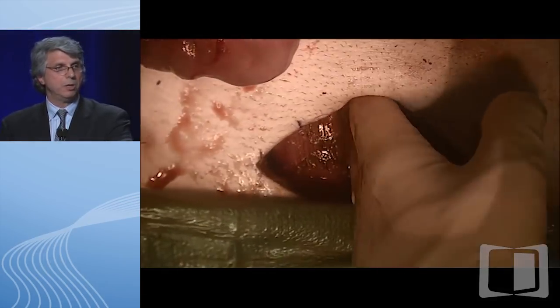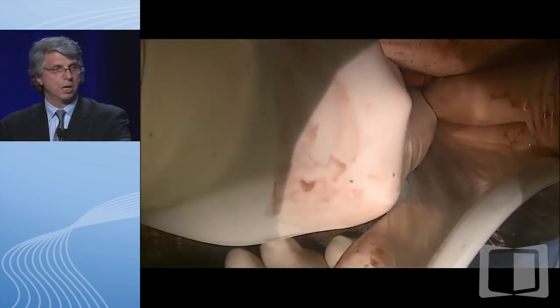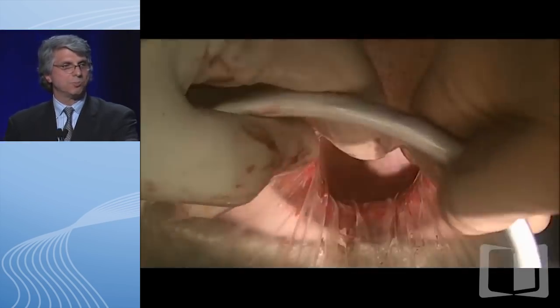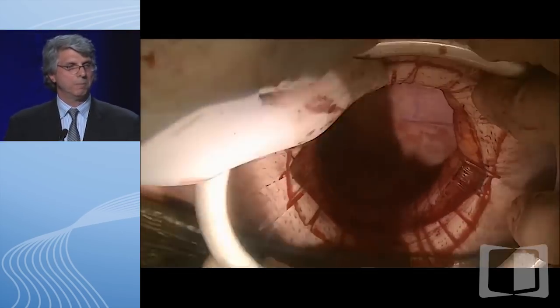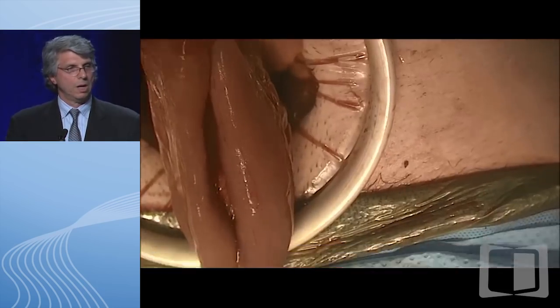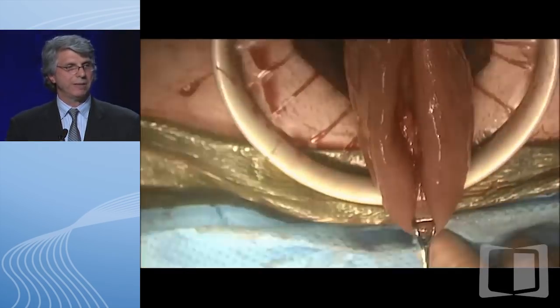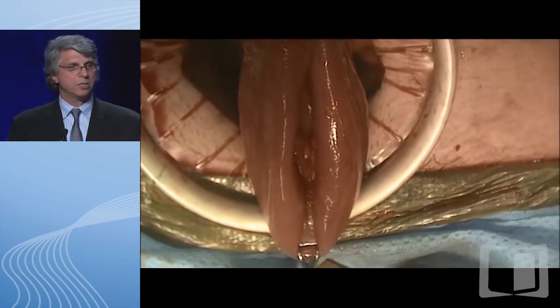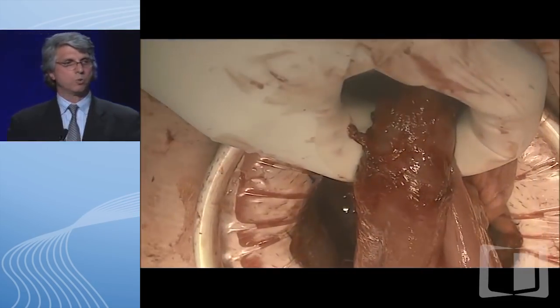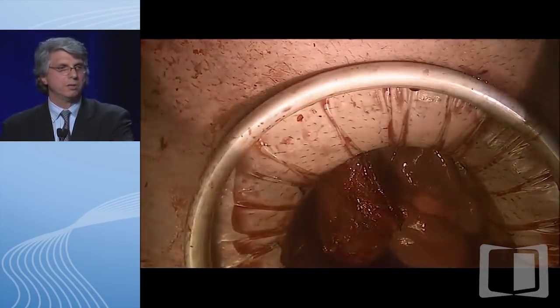You can see the ileostomy at the top left of the screen. The wound protector also allows us to splay open the wound so we can see a little better, making visualization of the pelvis much better. Now the next thing we do is make sure that the ileal J-pouch is going to reach down into the pelvis. Where that instrument is, you can see it's pulling the J-pouch down—that will become the apex of the J-pouch, which will be hooked up to the anus. There are two loops of intestine folded back on itself, and we're assessing the length to make sure the J-pouch can reach.